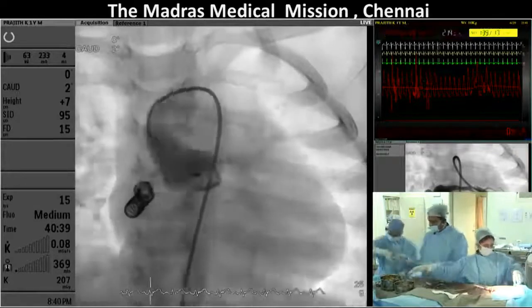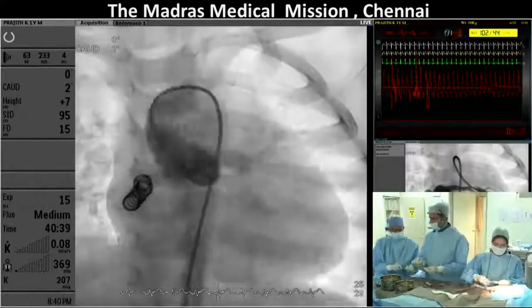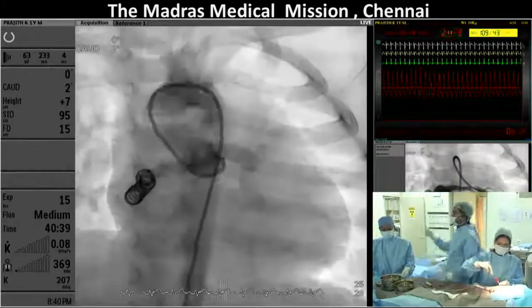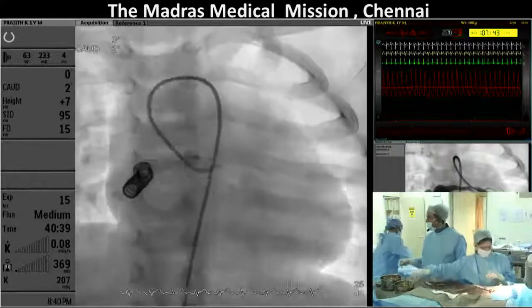And also a suggestion from Mansoor, who got the percentages wrong earlier on: for completion, do a right coronary angio as well. Yeah, get me a pigtail. I'm going to rub this in. Yeah, a 5 French pigtail.